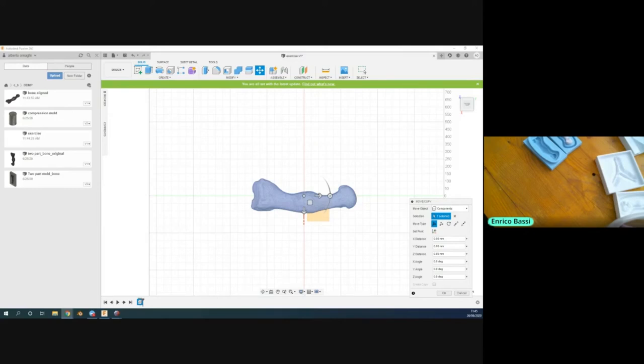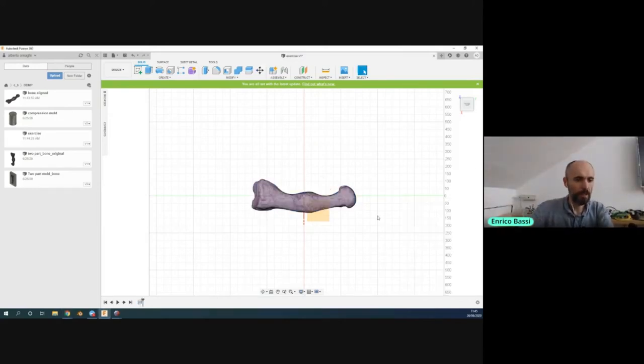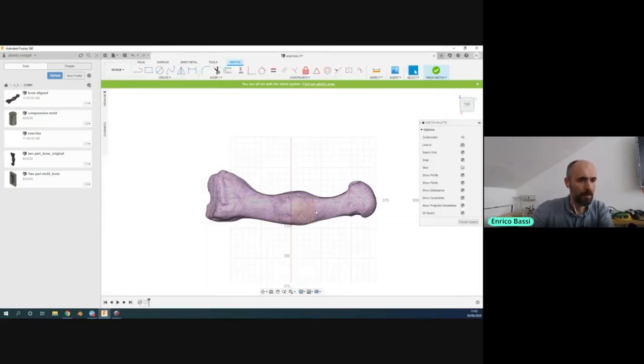Let me change the video. Okay, so you got the reference object here. At this point, around the object, you can design your alignment keys. You have to stay close, but you know, it doesn't matter exactly how close you are.